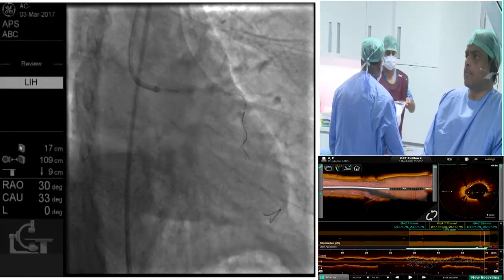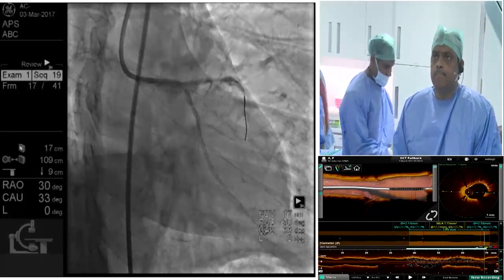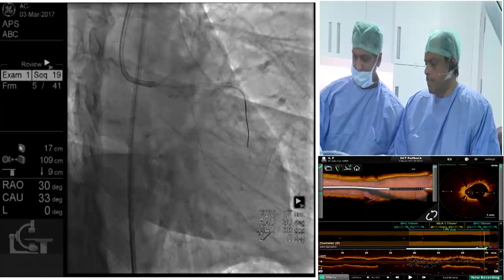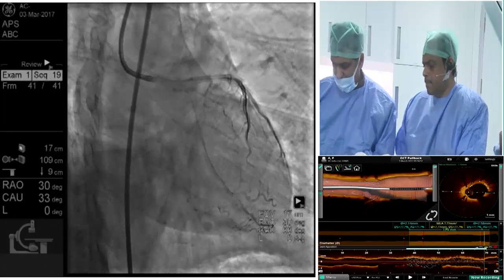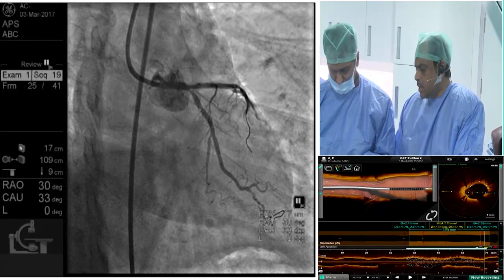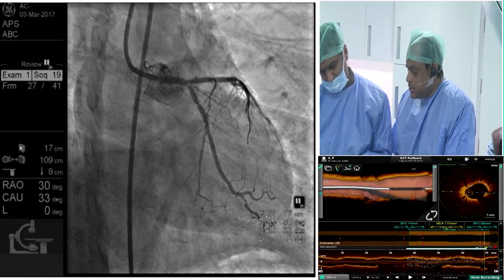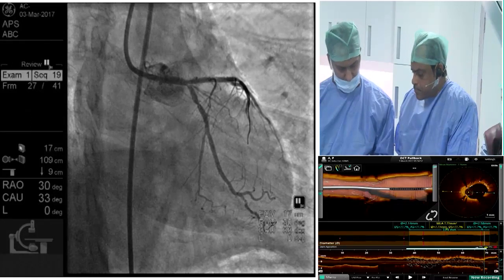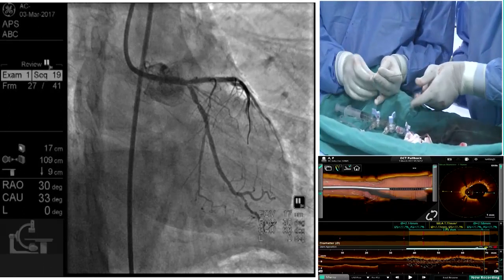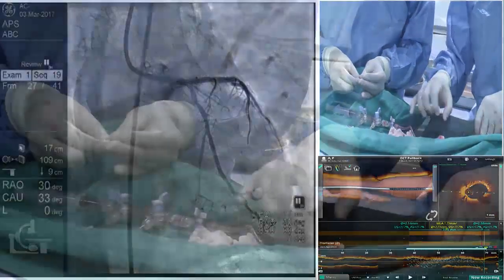Your balloon burst already, so we don't have many options left. Sometimes I find it helpful to put a balloon in the left main and then use a StentBoost to see the stent struts in the LAD better, so that you know which stent struts to go to. Okay, we can do that. Once you pre-dilate it, I think the wire is going to go back into the same path again and again.